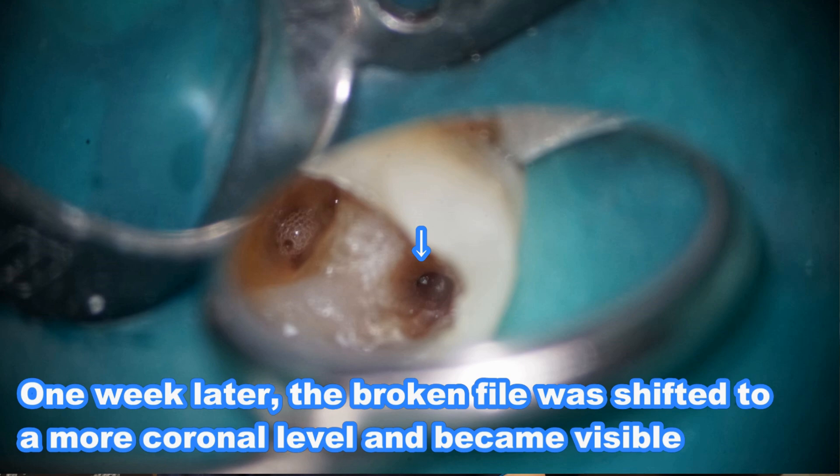However, one week later, I found the broken instrument completely visible, perhaps because of pressure from the periapical tissues. It had automatically shifted to a more coronal level, so I was now able to see the broken instrument.